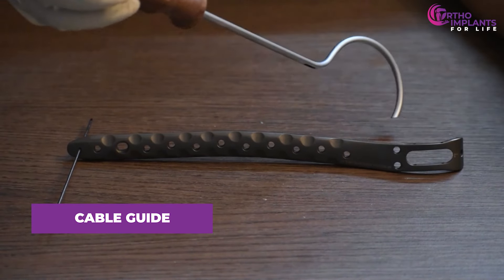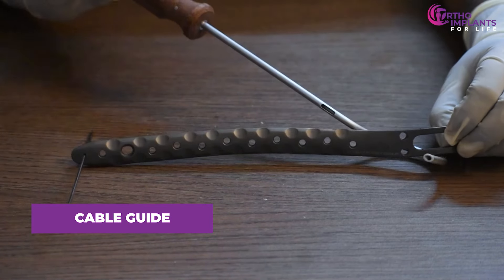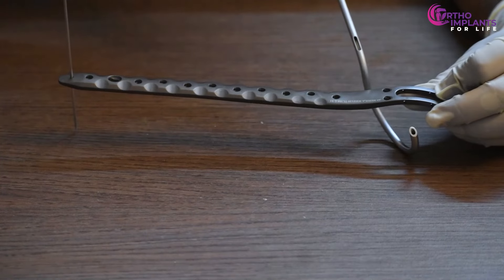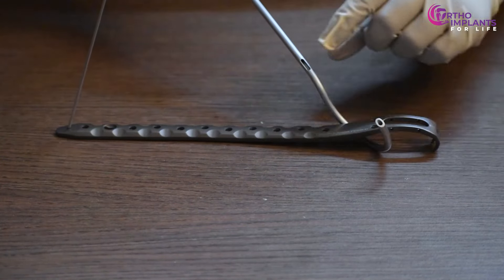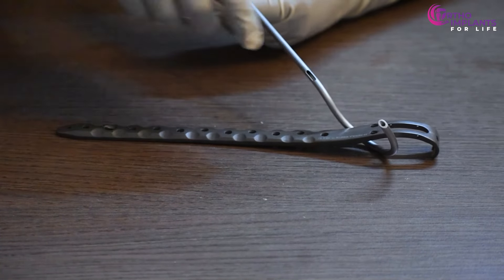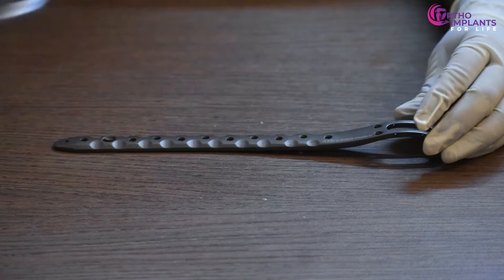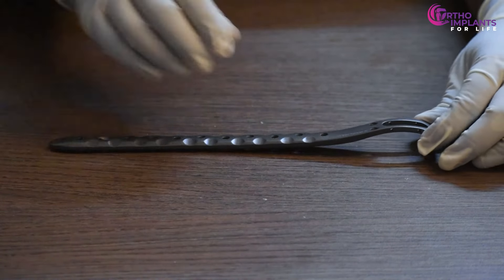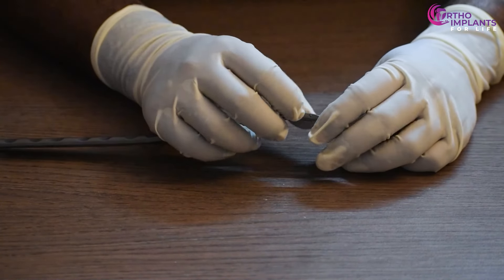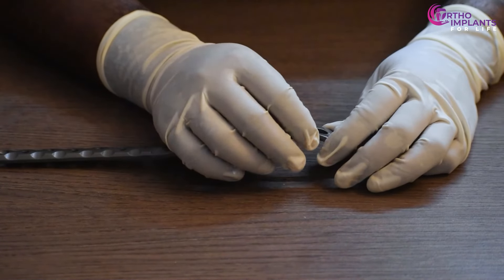We will insert the cable guide and then go around the bone and plate, with the plate staying on top of the bone. Once the cable guide is in place, we can insert the wire through this hole and it comes out from the other end — that's what keeps the plate in place. Once the cable is through, we need to pass it through the hole on the proximal side of the plate.